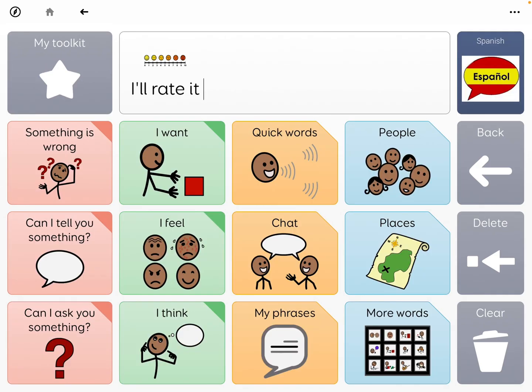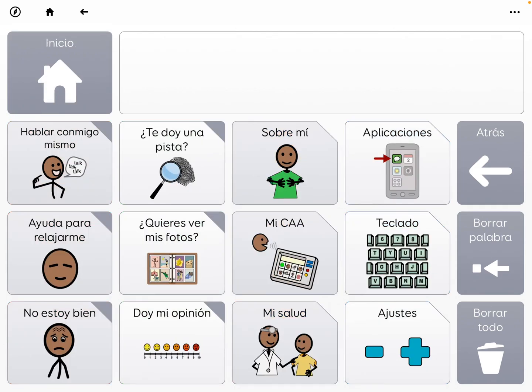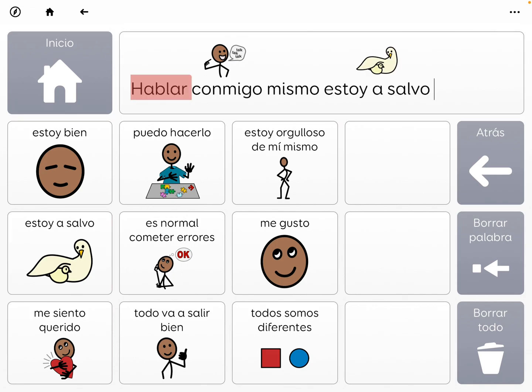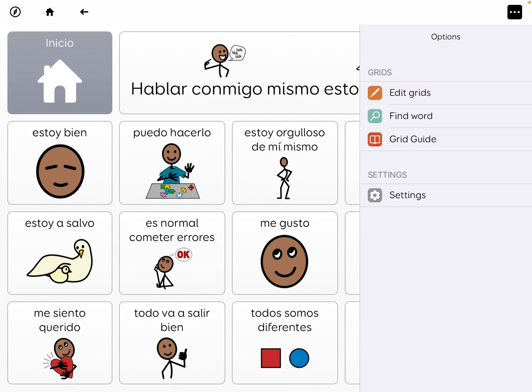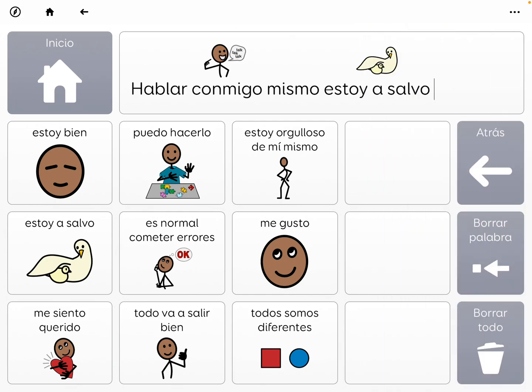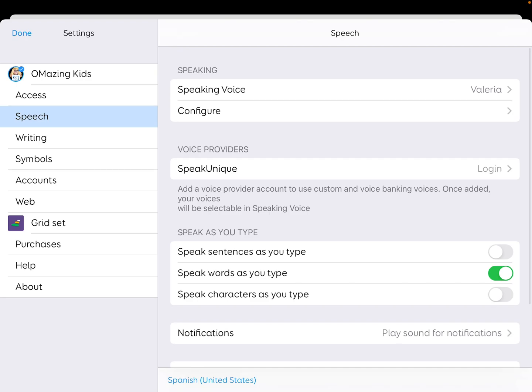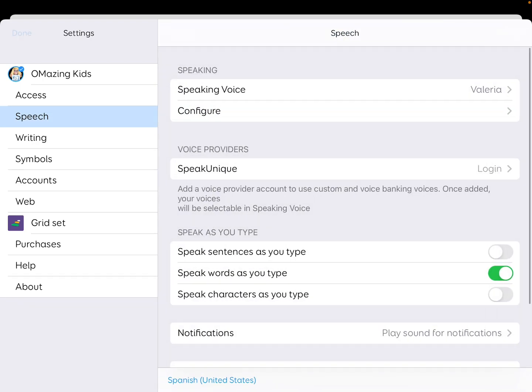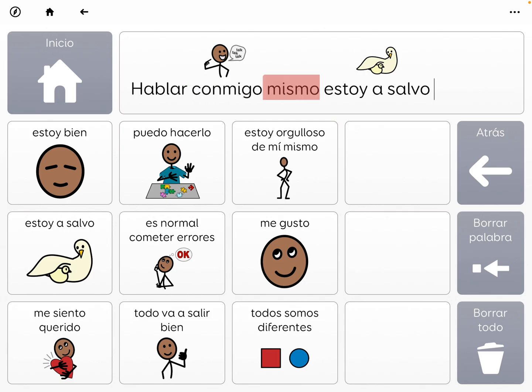I'm going to go back to home, and then that same identical content — if I wanted — I can go over into Spanish. Going up to the star: 'Hablar conmigo mismo. Estoy a salvo.' And that was pretty fast. Let me go into settings and adjust some things here — slow that down a bit. 'Hablar conmigo mismo. Estoy a salvo.' A little bit better.